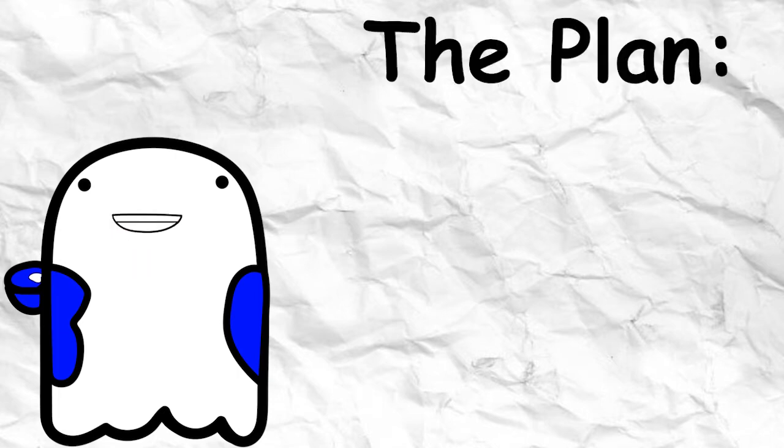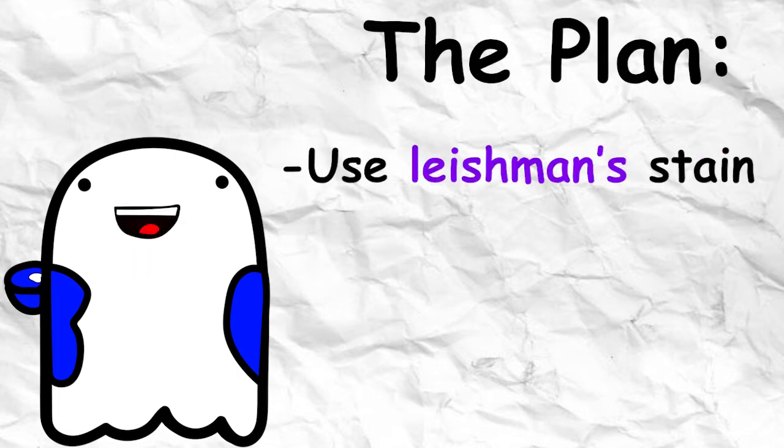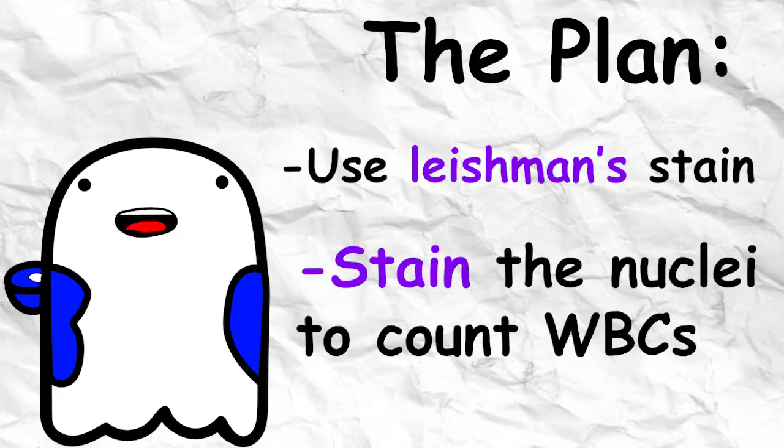Phew, that's all of the nerd stuff out of the way. Now I understand why Michael Rees leaves out all the coding elements whenever he does a video. Anyway, on to the actual project. Today we are going to use Leishman stain to stain the nuclei of white blood cells. Okay, just like a little bit more nerd stuff.